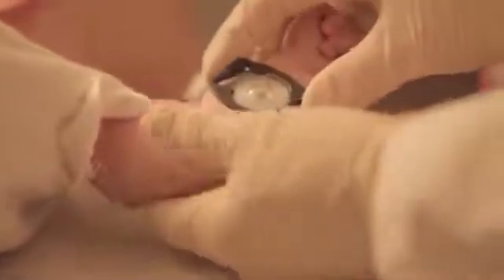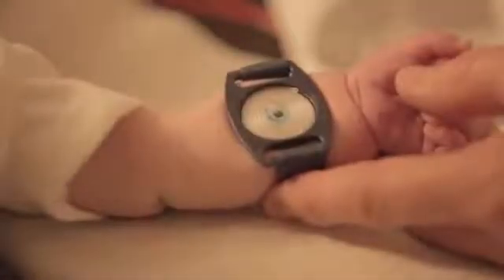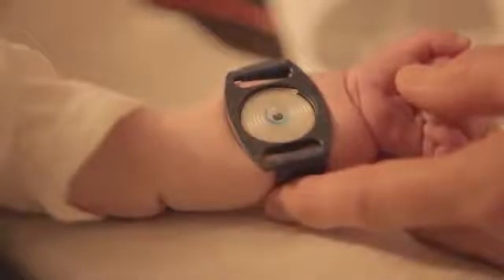Proceed to the next step immediately. Apply the concave surface of the macro duct collector precisely over the area of skin contacted by the pilot gel where the red electrode was located. Thread the unconnected end of the strap through the other slot of the collector and tighten the strap until the collector is firmly attached, with strap pressure pulling as evenly as possible from each end.